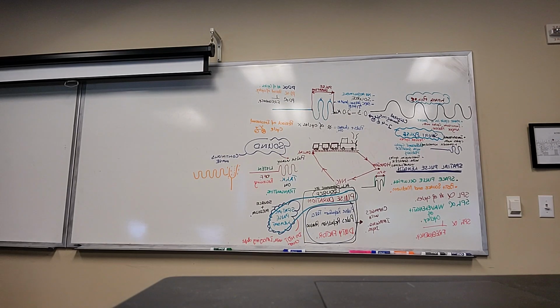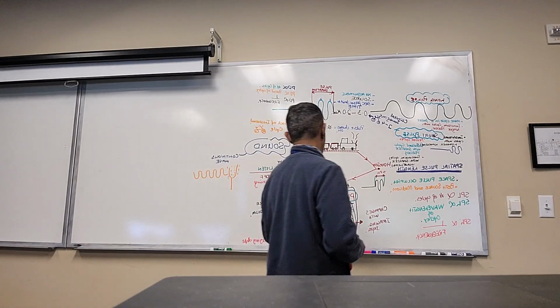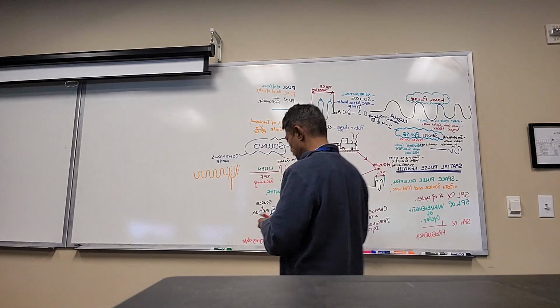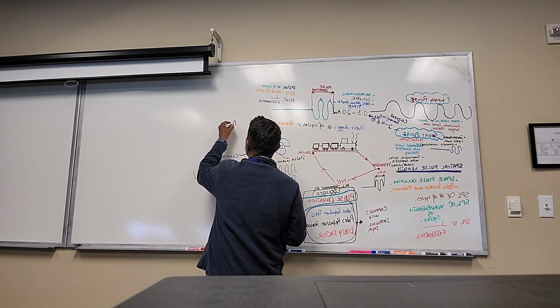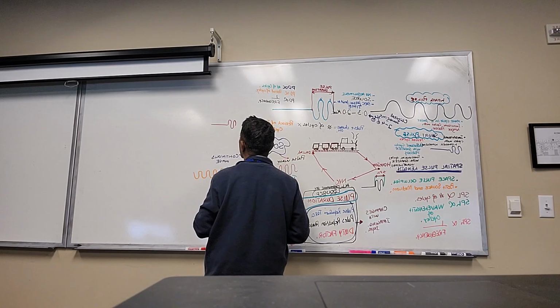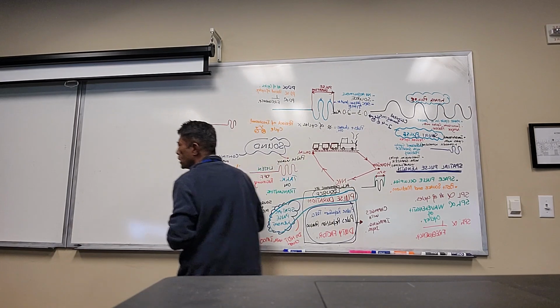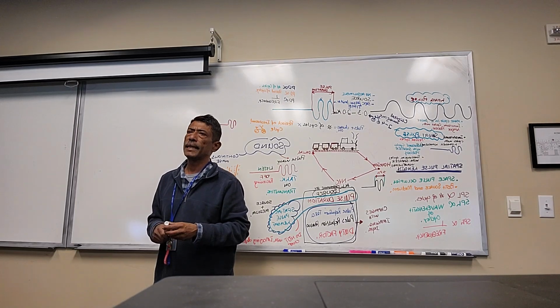Now let's come to PRP. What is a PRP? Pulse repetition period. So if this is a pulse, up, down, PRP, as they say, changes with the imaging depth.